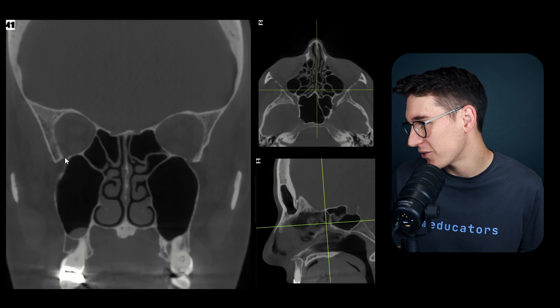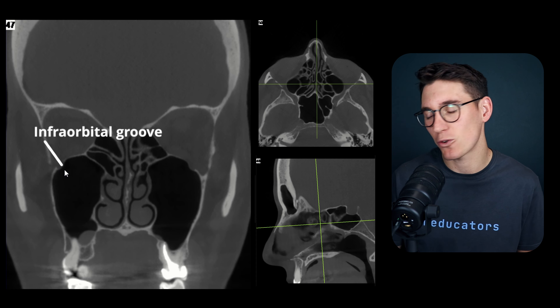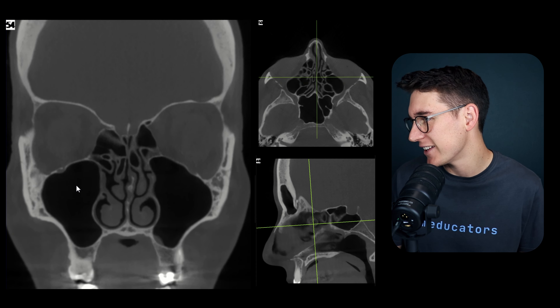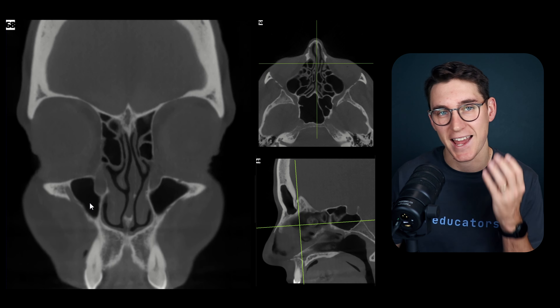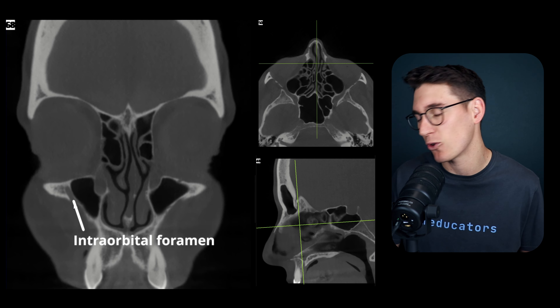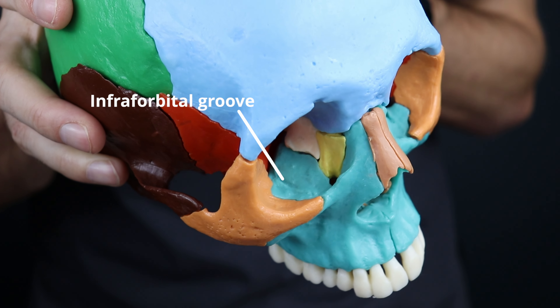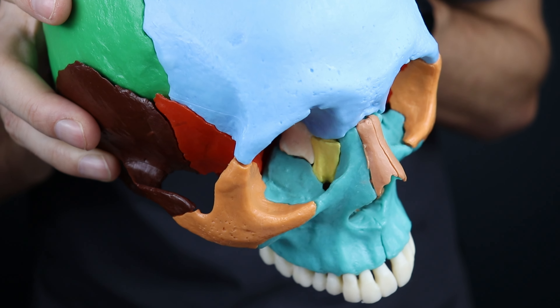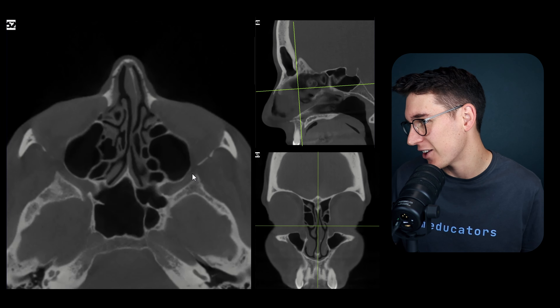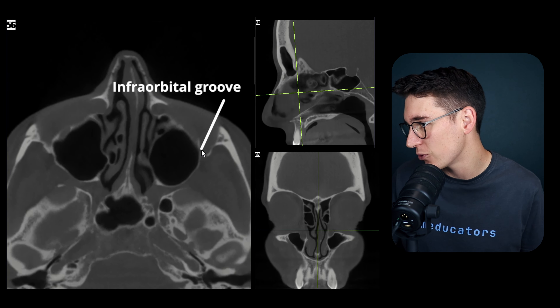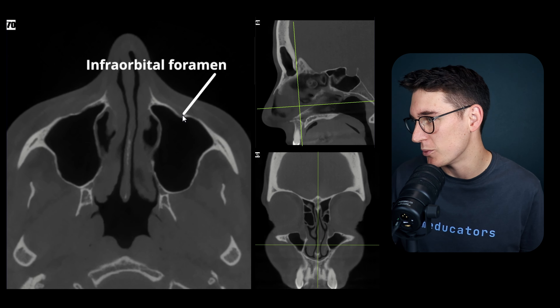On our coronal slice, here's the inferior orbital fissure heading out laterally. As we scroll forward, a groove forms known as the infraorbital groove. Heading more anteriorly, that groove becomes the infraorbital canal, which then exits at the anterior surface of the face as the infraorbital foramen. This is also visible on our 3D model and confirmed on the axial scan - the groove becomes a canal and exits anteriorly as the infraorbital foramen.